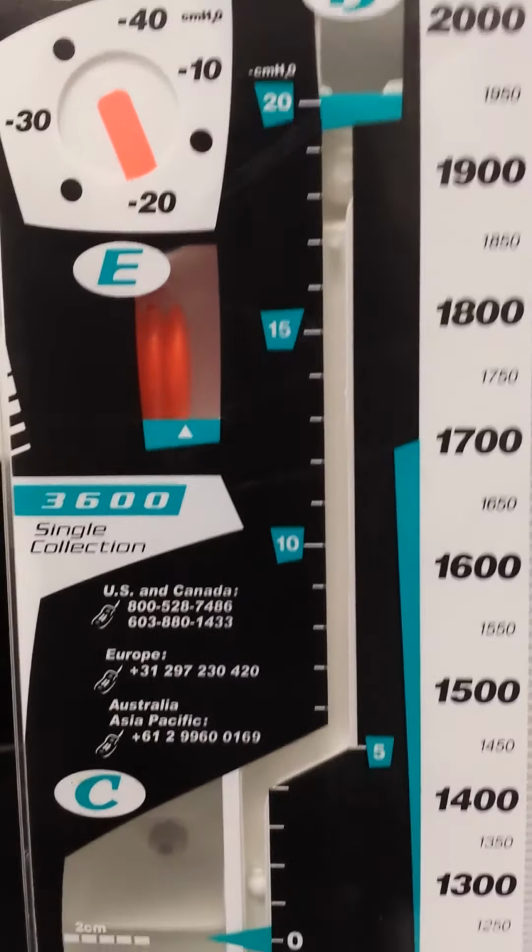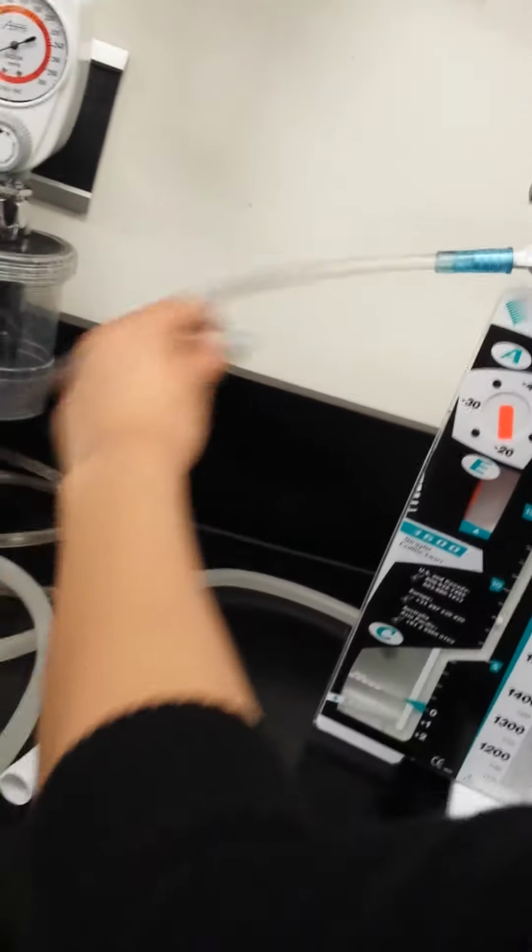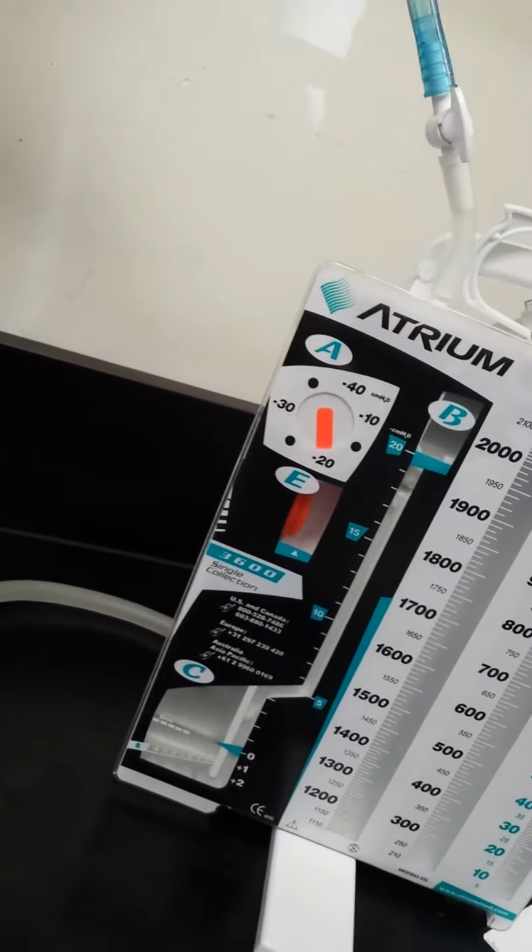Okay, that's good. So then that's when you know that your suction's working and it's fine, and that everything is set up together. So that's the end of that one. So what was wrong with it? It was just kinked, so you just kind of had to lift it up. Yeah, okay, that's good. Stop that now.